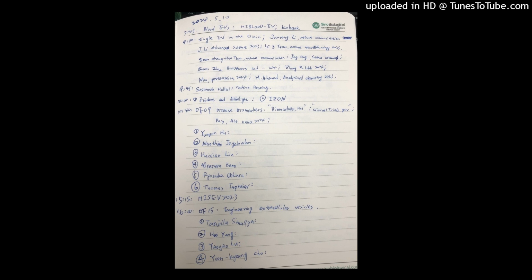And Rick, I have another question about biobanks. Because there aren't biobanks that would store platelet-poor or platelet-free plasma, so I just wanted to know if we analyze EVs from a plasma that's stored as plasma and another from the same person stored as platelet-poor plasma. So both stored at -80 and then we analyze both. Do you think there would be differences? Because this might have some residual platelets, but that's got the full population really. Yeah. So I'm not, well, sure.